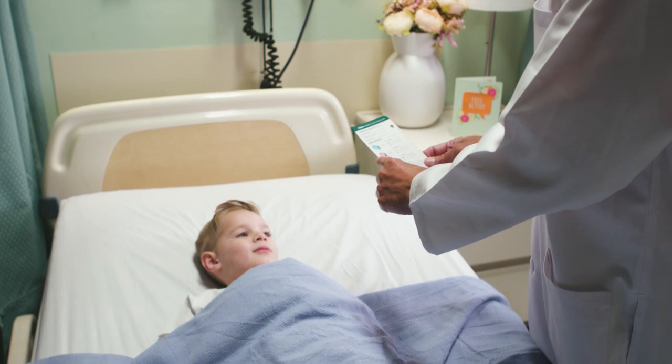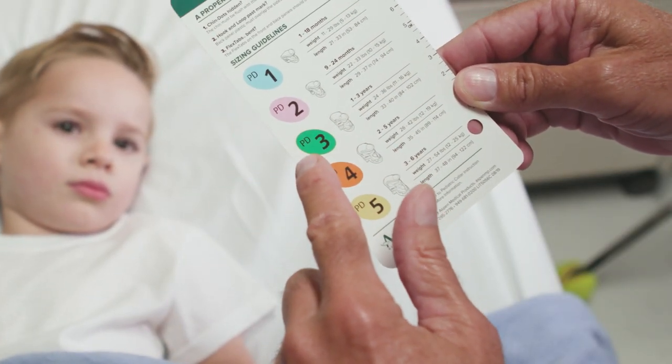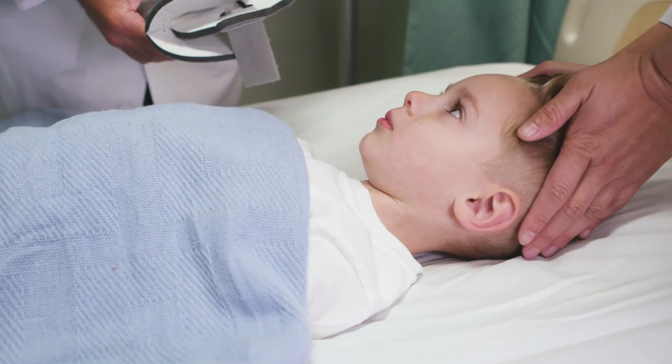To properly fit a patient in this product, first determine the appropriate collar size using the pediatric sizing guide. Ensure that the patient is supine and that the head is maintained in neutral alignment.